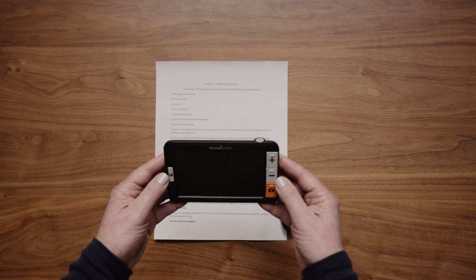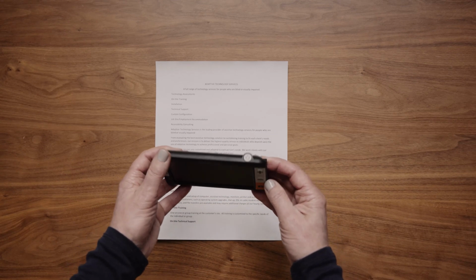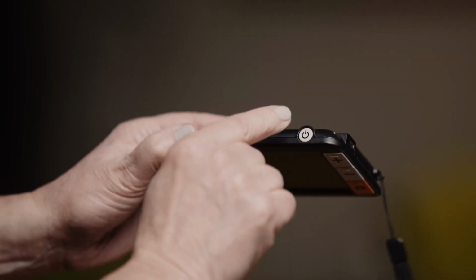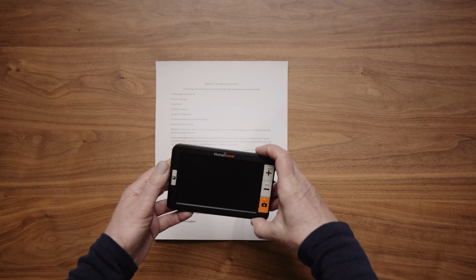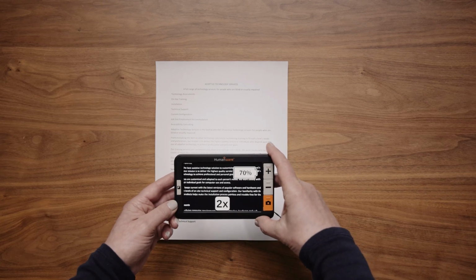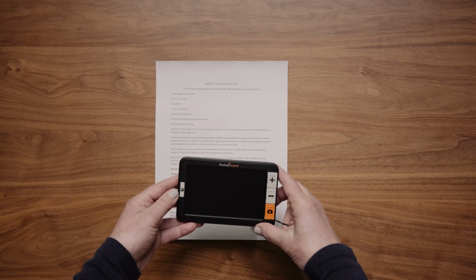Turning the Explore 5 on or off. Using the power button. 1. Press and hold for 2 seconds to turn on the Explore 5. 2. Tap once to turn off the Explore 5.